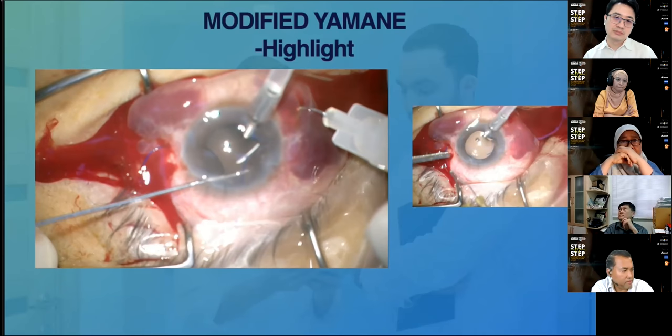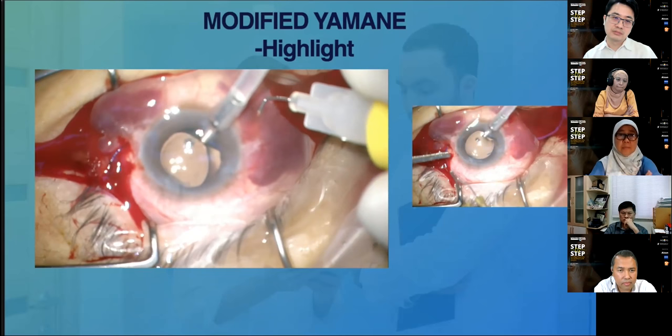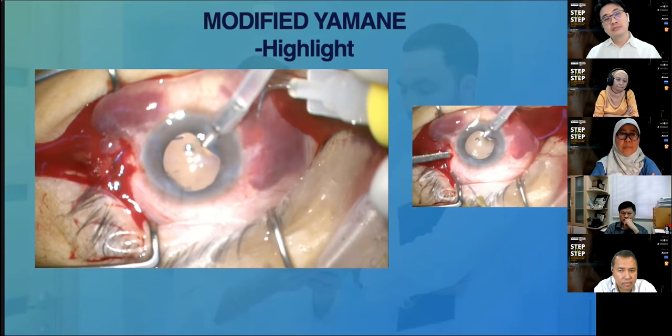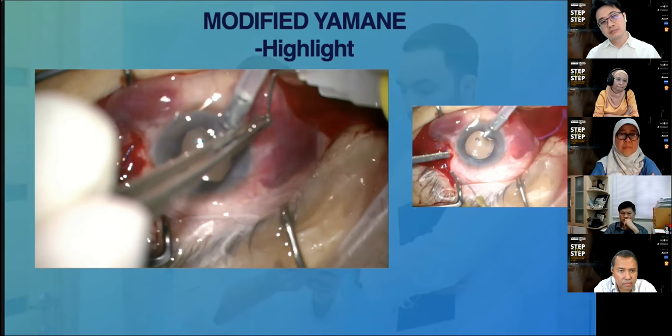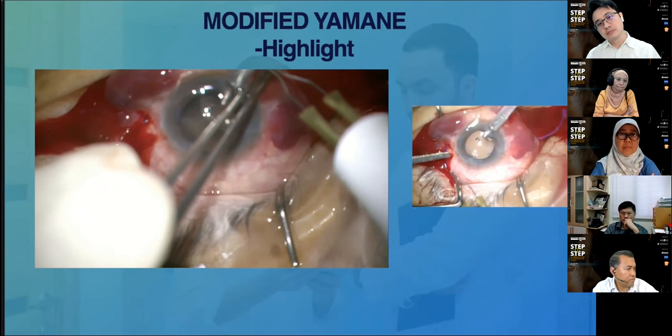the initial externalized haptic was stuck in too early, maybe. Probably even before the externalization of the second haptic, because ideally, the best thing to do is to keep both haptics loose and make sure that the leading haptic is outside the eye, even after we have created the flange. And only after we have externalized both haptics outside the eye, then we secure both flanges underneath the scleral bed, within the scleral bed.